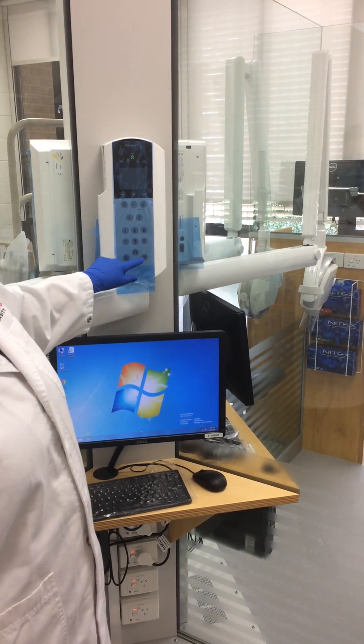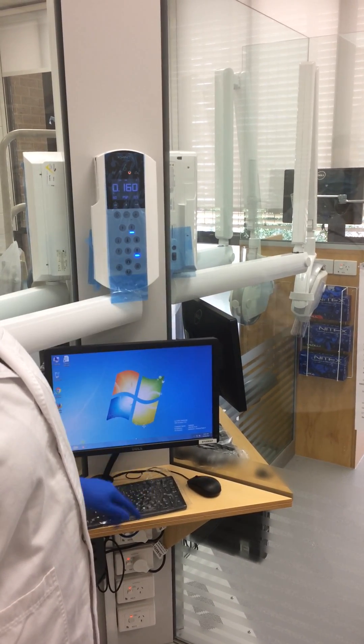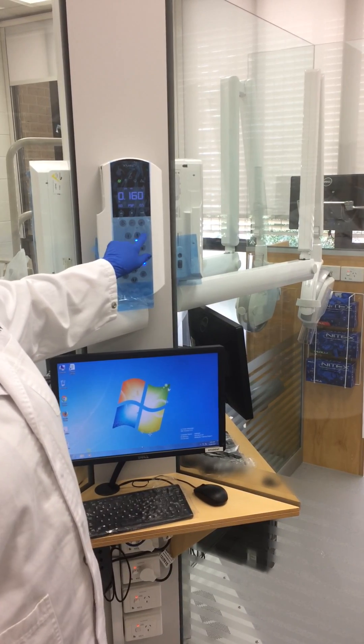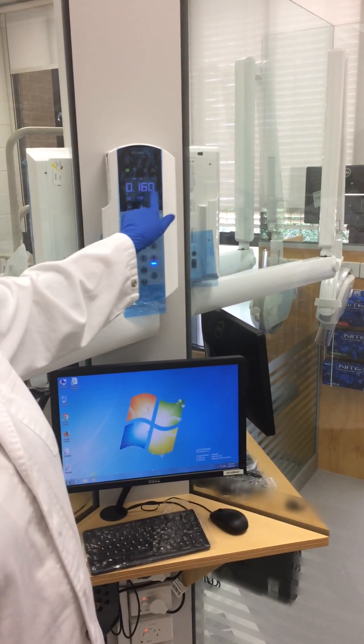In this case we're taking a posterior bite wing, so we're going to press that button. As you see it comes up, you'll press adult, posterior bite wing, and that comes up with the exposure.